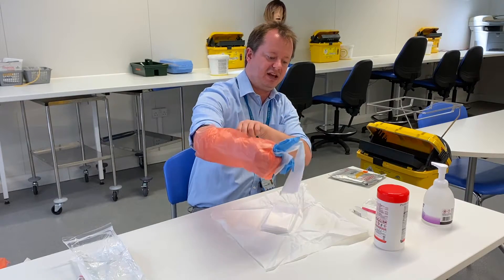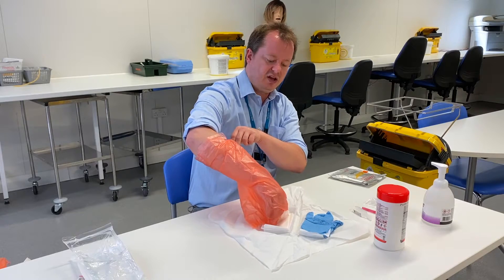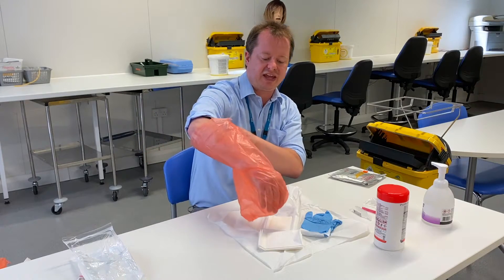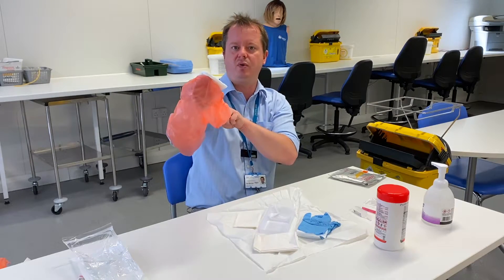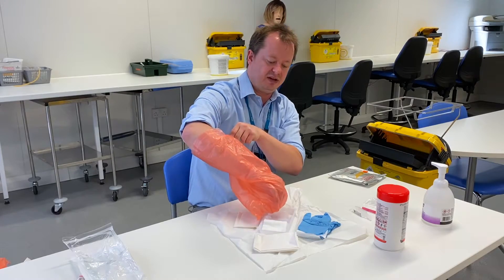You've got the sterile gloves here — these are medium so I won't be using those, they're a bit too small for me. You've got an additional sterile field, which you can use to cover the area you're going to be working on, like the cannula or the wound or whatever. You've got another sterile field here, five sheets of gauze which you might use to clean the area, and a pot for liquids that you might be using.